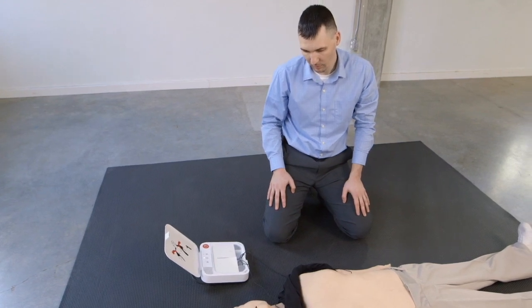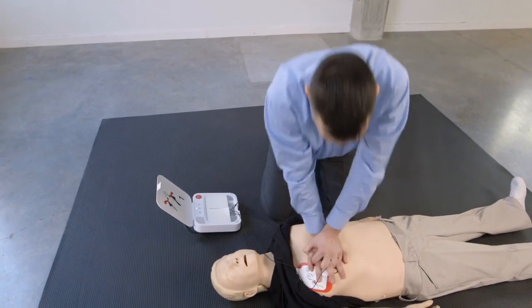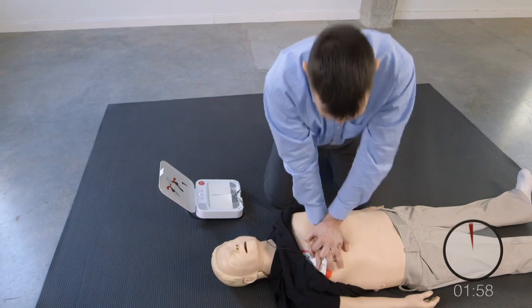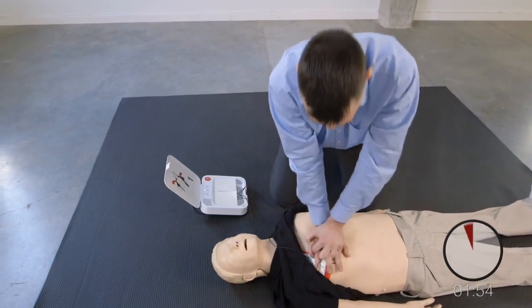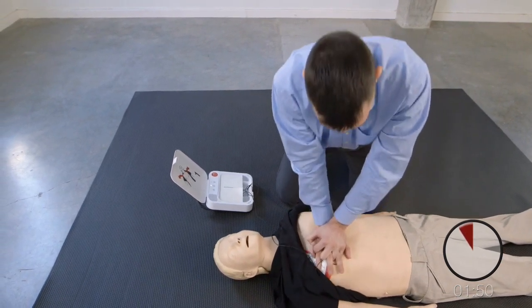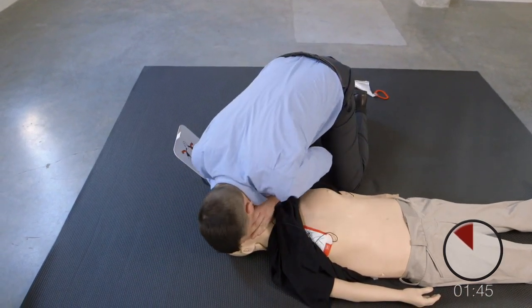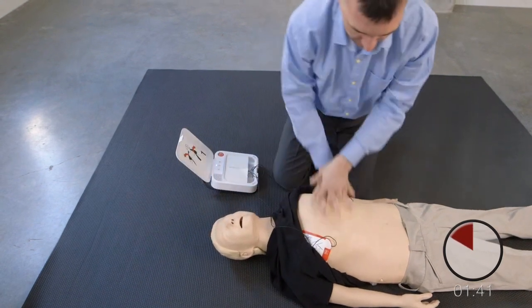Ge bröstkompressioner. Följ takten. Ena handloven ska vara mitt på bröstet. Den andra placeras ovanpå. Tryck ner hårt minst fem centimeter. Gör två inblåsningar. En. Två. Återuppta bröstkompressionerna.